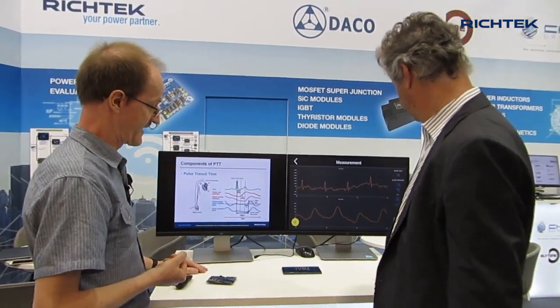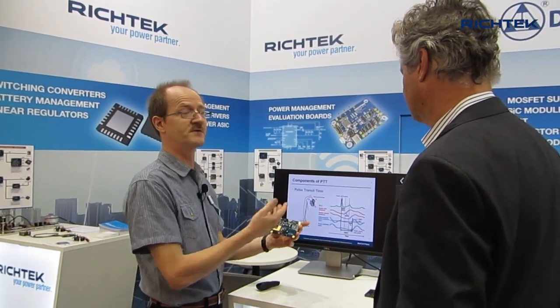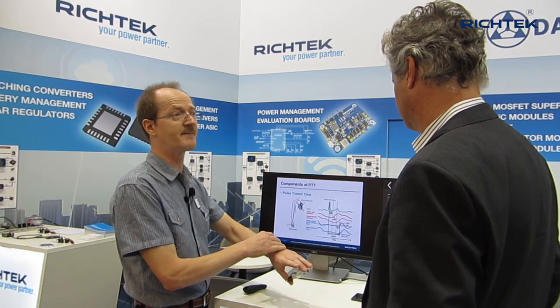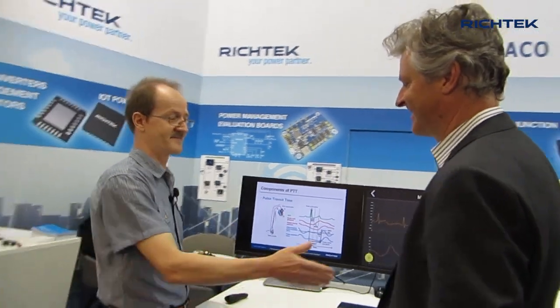Axel, I hope this was interesting for you — it's really an interesting application. We will try to make a kit which includes the evaluation board and an app that we can provide to our customers, so they can see how it works and try to develop their own application, whether it's a sport watch, a medical sensor, or basically anything they can think of.